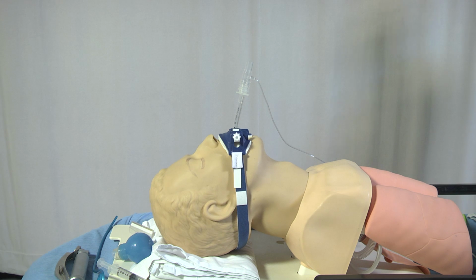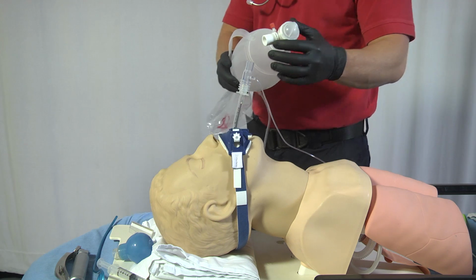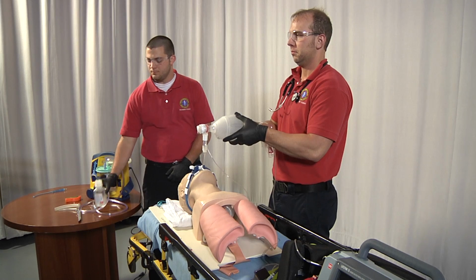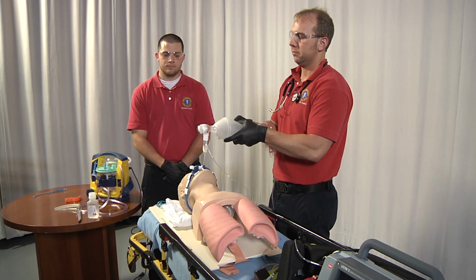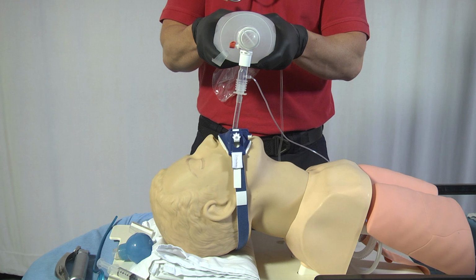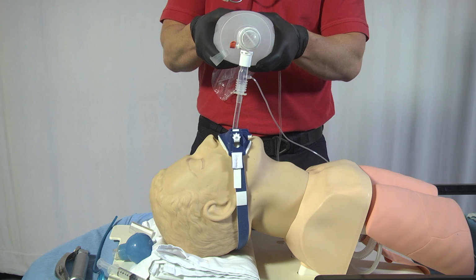For the second part of this video, we will discuss the techniques necessary to perform suctioning through the previously placed endotracheal tube. Prior to suctioning, ensure that you have sterile water or saline available to clear the flexible suction catheter after suctioning. Recognize the need for suction, including excessive secretions, mucus obstruction, or vomitus in the endotracheal tube. Ensure ventilations are continued while preparing to suction.